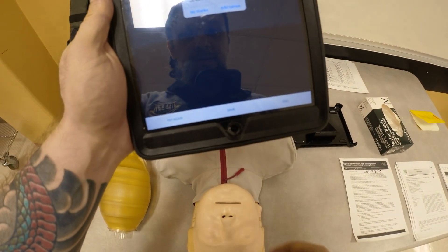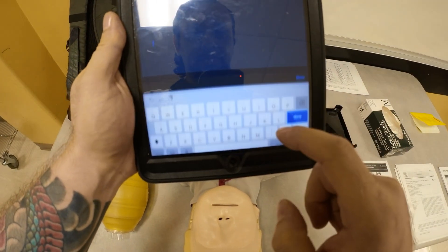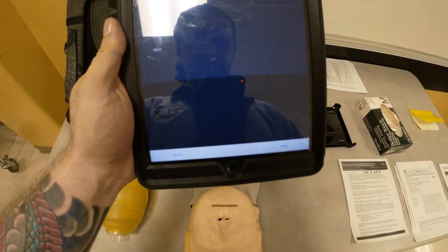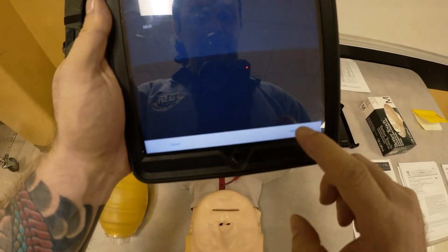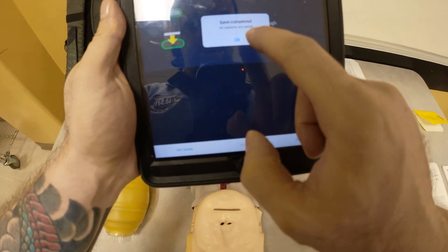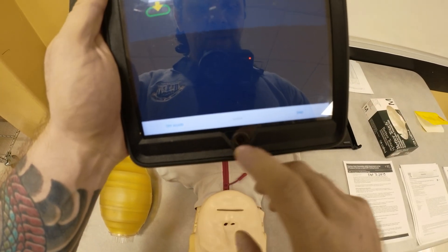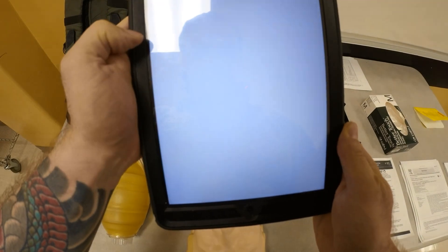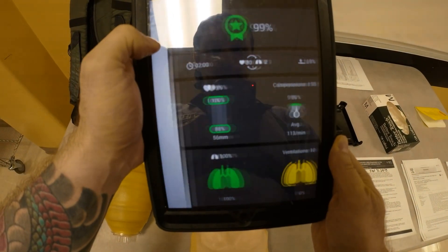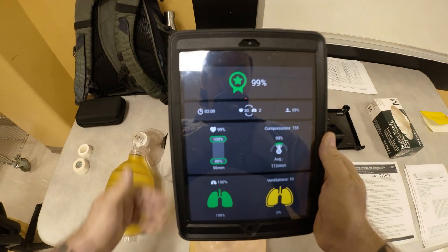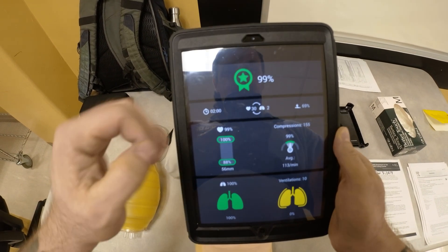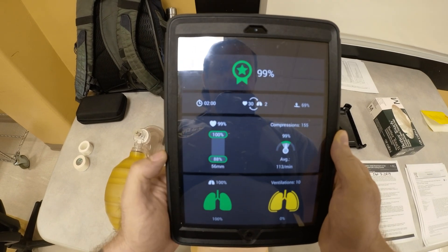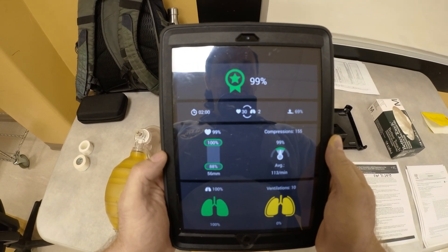I'm going to save, add a name — say Nick — done. And I want to see my data. So let's go ahead and look at our saved results. This was our data, and this is the information that I am able to see. We did it for two minutes, so our total cardiac arrest time, our total code time, was two minutes.